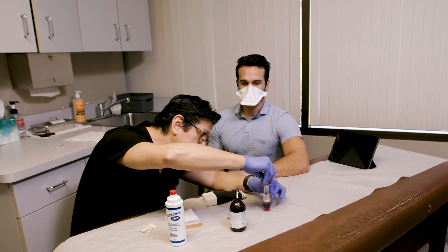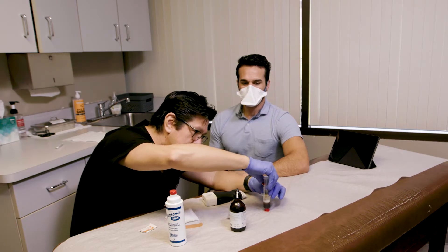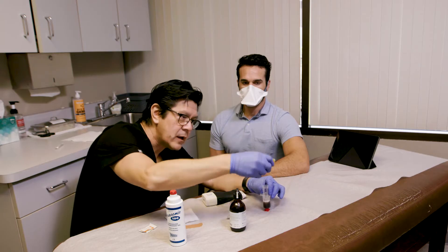We're going to stop early so we don't grab the white cells. We'll stop there — and that's what we're going to use.